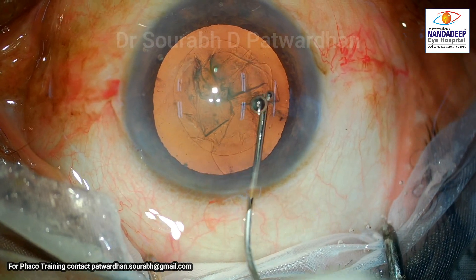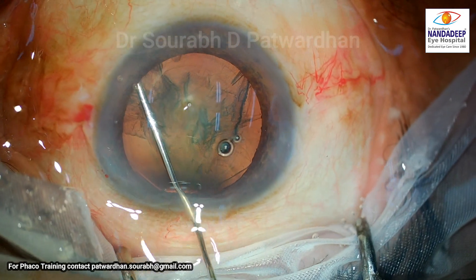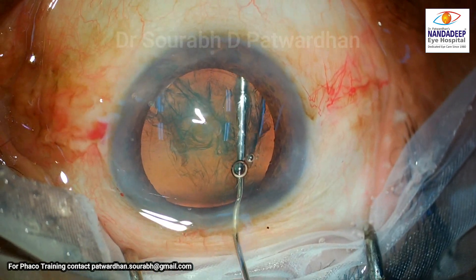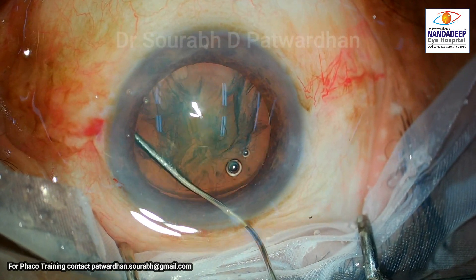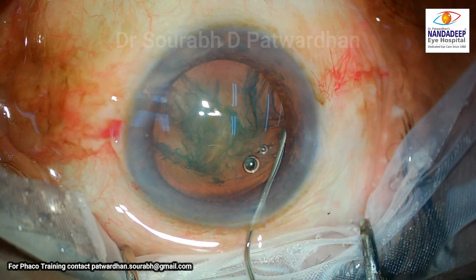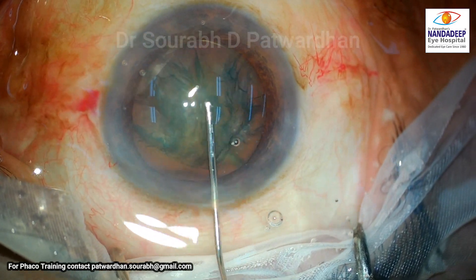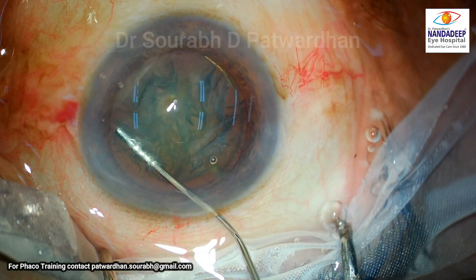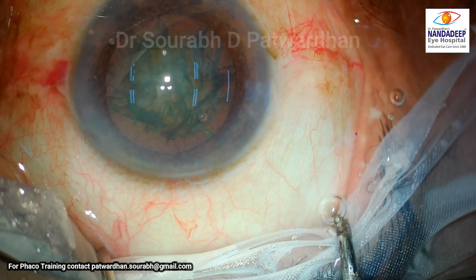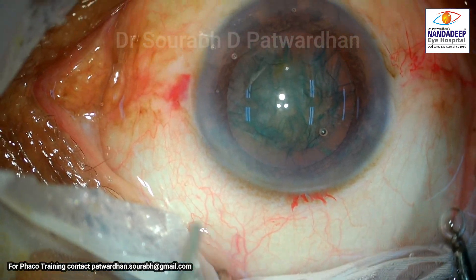The first hydrodissection did not occur — you can see the anterior chamber is deepening, which means hydrodissection is not happening. But the good thing is that the surgeon continues to attempt hydrodissection. First, hydro delineation occurred, and then hydrodissection could be achieved. It is very important, and it is good that the surgeon didn't stop after the first or second attempt but continued until achieving a good hydrodissection.